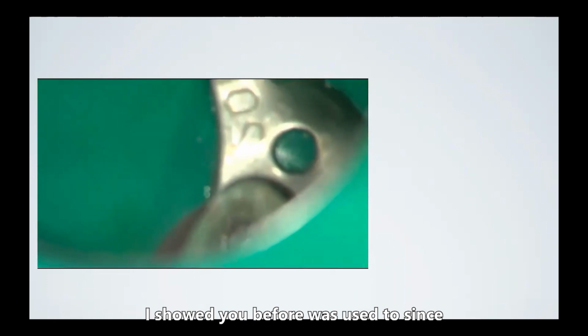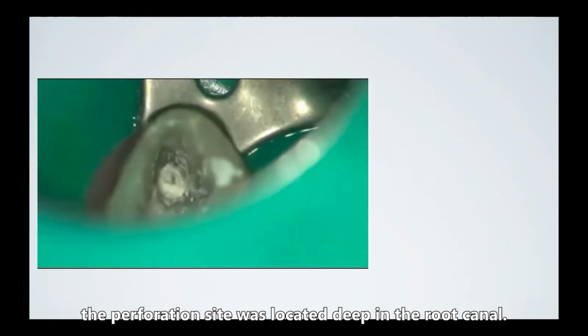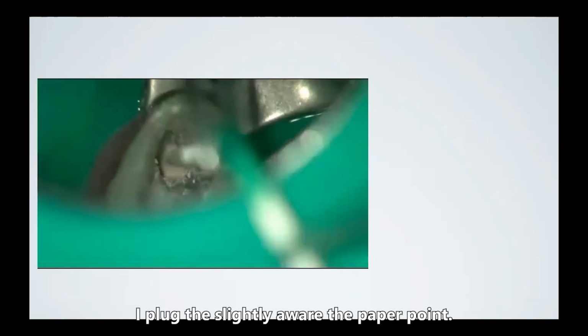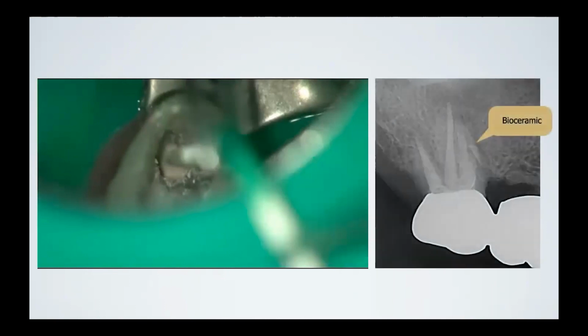Please note that a specially designed instrument I showed you before was used since the perforation site was located deep in the root canal. I plugged slightly with a paper point. After the completion of the root canal treatment, you can see the successfully repaired root perforation in the post-op X-ray image.